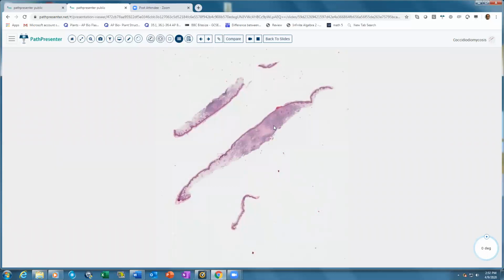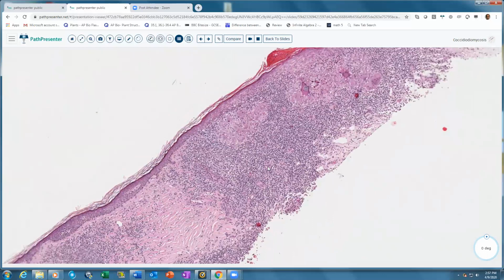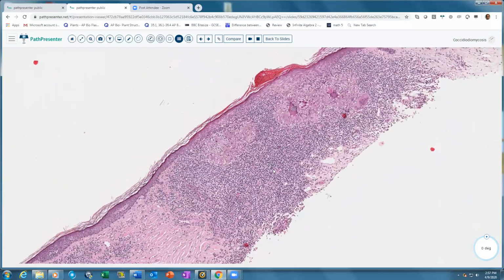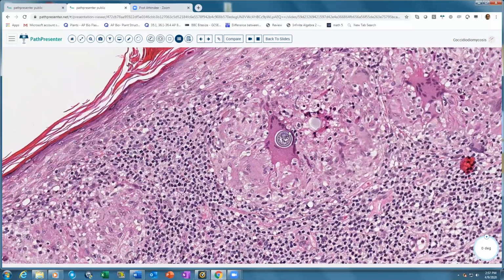So again, the same background, suppurative and granulomatous inflammation. You can see all the granulomas, you can see the inflammation here. And then when you hone down, you can easily see the organism. You see this big organism here that is usually 10 times the size of the lymphocyte, around 80 microns. And they have multiple endospores.